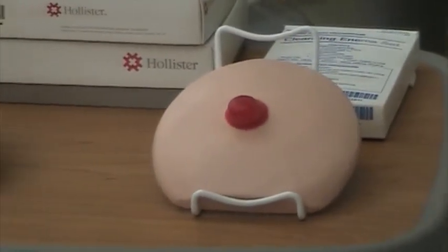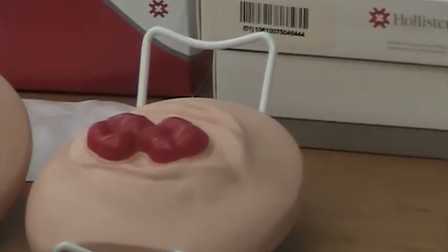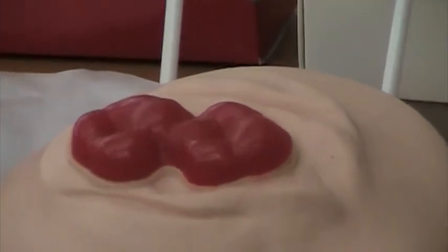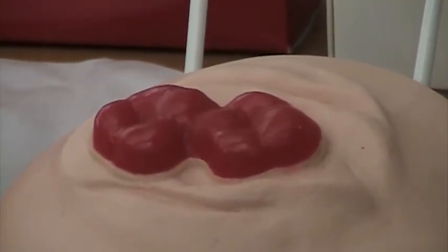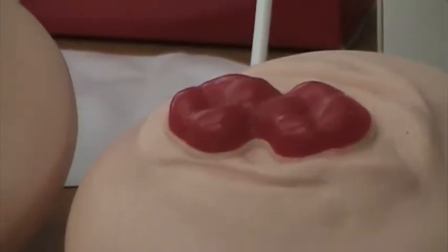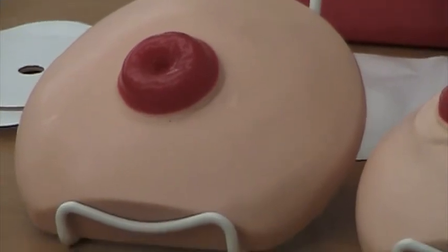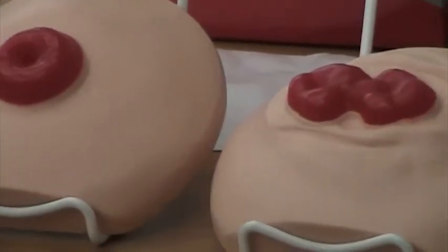Okay, this is the double barrel stoma I was telling you about. That may be where you use the great big ring to cover both of them. One drains the stool, the other drains mucus. And then you have just a regular stoma. So these are in the lab for you to look at. So come down at some point and take a look at them.